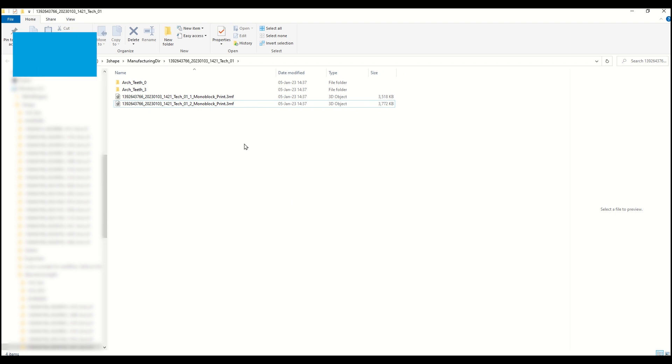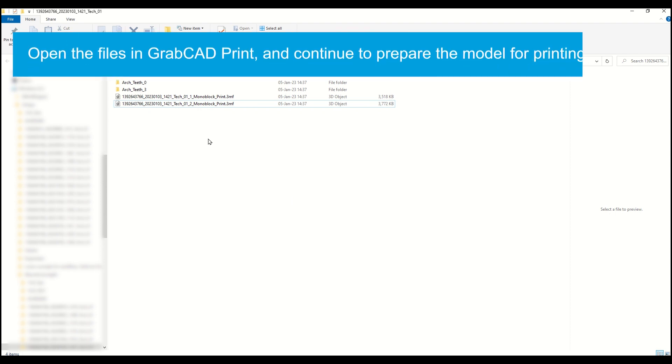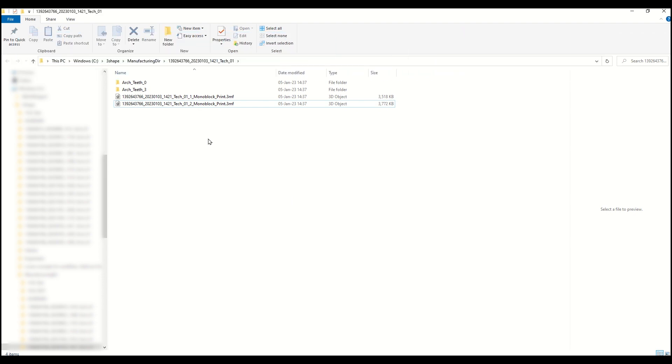Now we're going to need to open the same files in GrabCAD Print and prepare the models for printing. This will be explained in a future video.